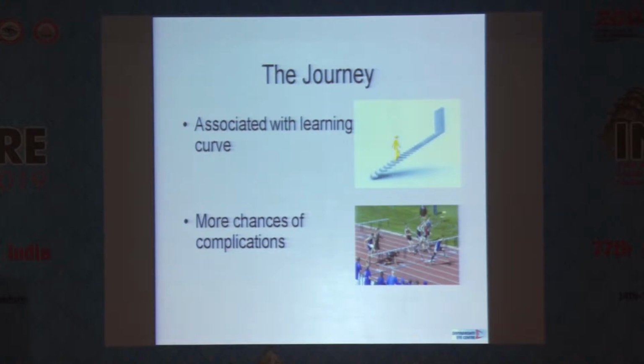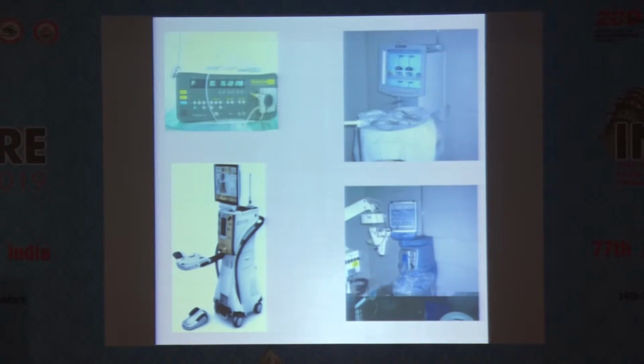Actually, this course is basically a basic course, so I just wanted to put some slides. If you are starting your journey as a phaco surgeon, you must attend. Nowadays, we have a lot of SSTC courses in AIS also, and even state level courses, conferences. So you must attend those, so you could know how to coordinate the foot pedal, your hand, your eye, your foot, and everything. And everybody has to go through a transition phase.